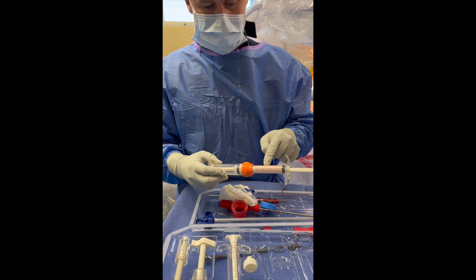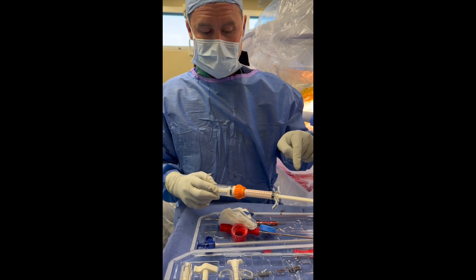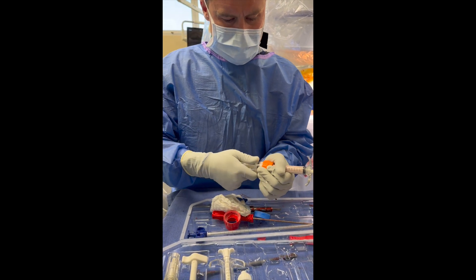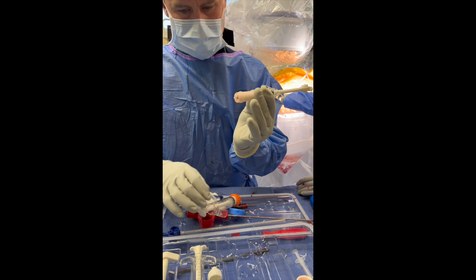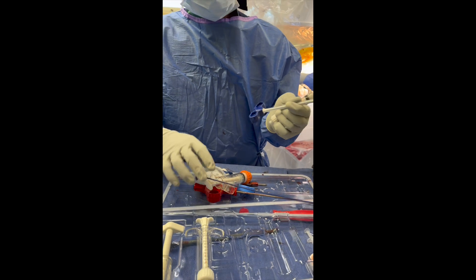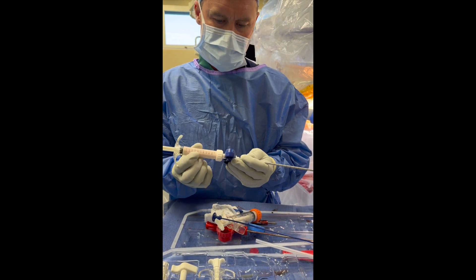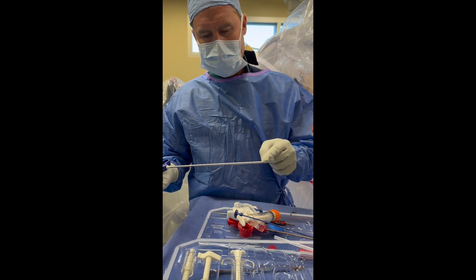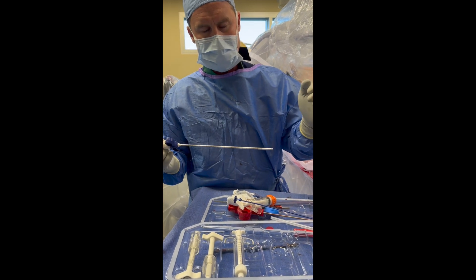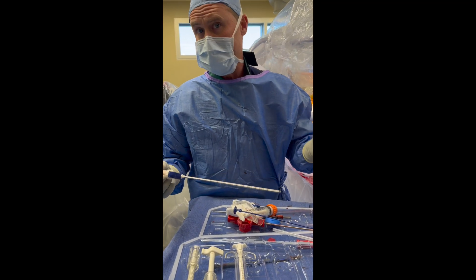We've got our bone graft in here. This is calcium sulfate, calcium phosphate, demineralized bone matrix, or DBM, combined with the patient's autogenous mesenchymal stem cells. This is all mixed together here. It goes into this applicator. There you can see the bone graft. This long applicator goes on, and this allows us to inject this bone graft up into the femoral head through a small incision in the lateral cortex of the bone and deliver this new bone up into the femoral head to restore architecture, provide support, and hopefully reverse the process of avascular necrosis.